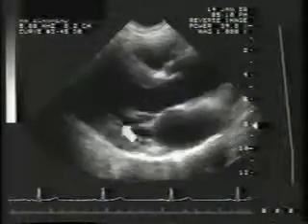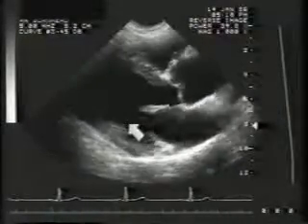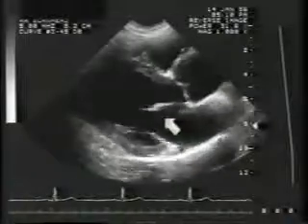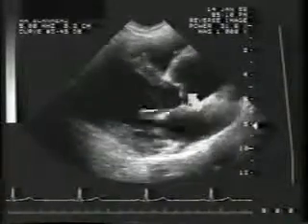We will now display the image in real time. Notice the normal contractility of the left ventricle and the opening and closing motions of the mitral and aortic valves.